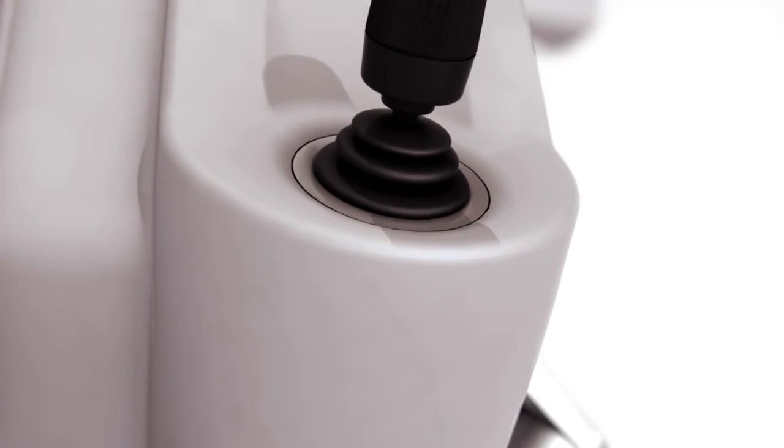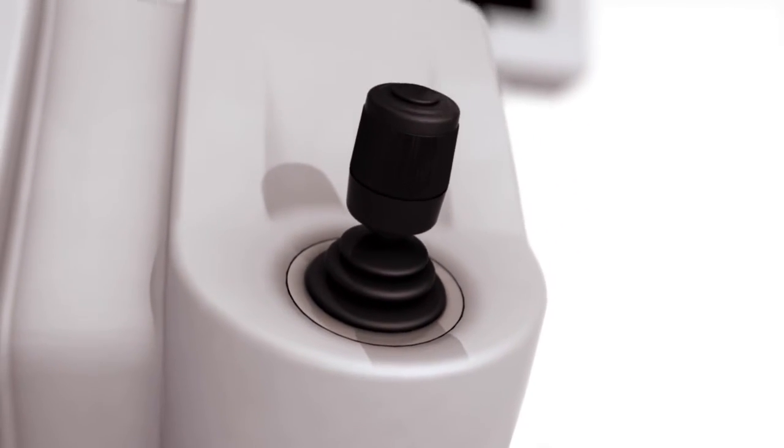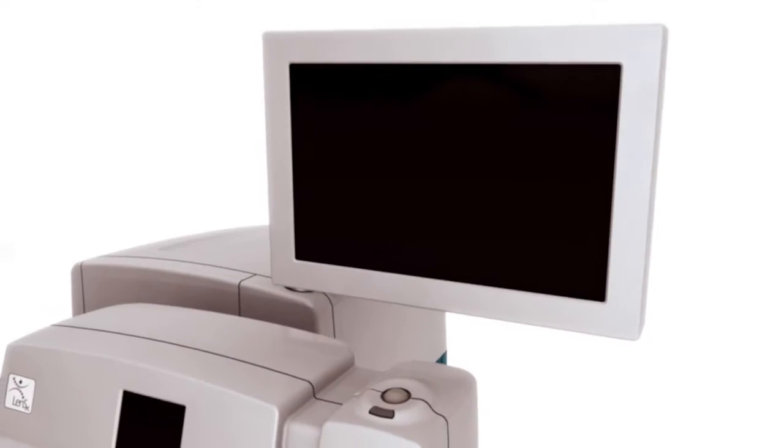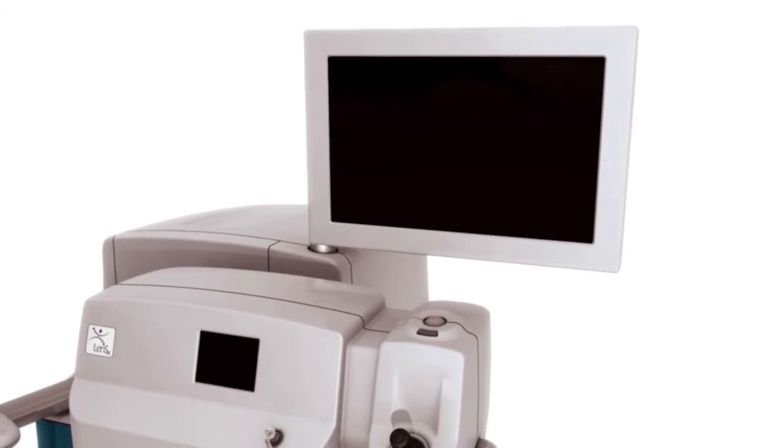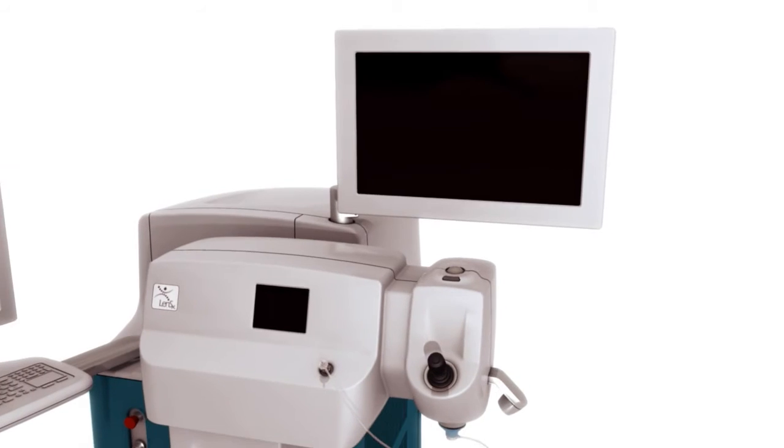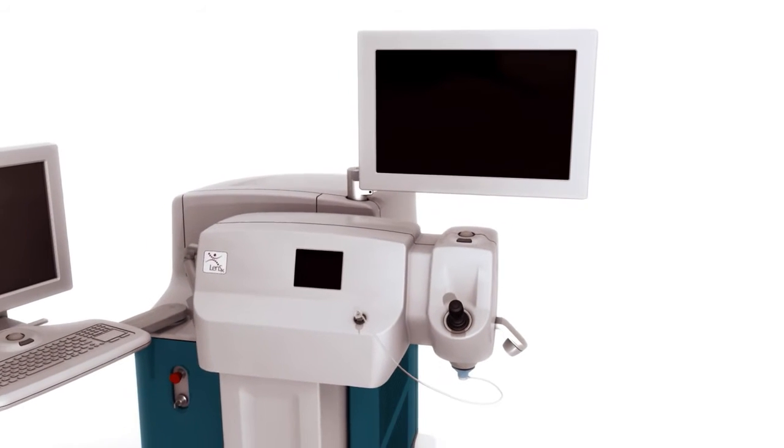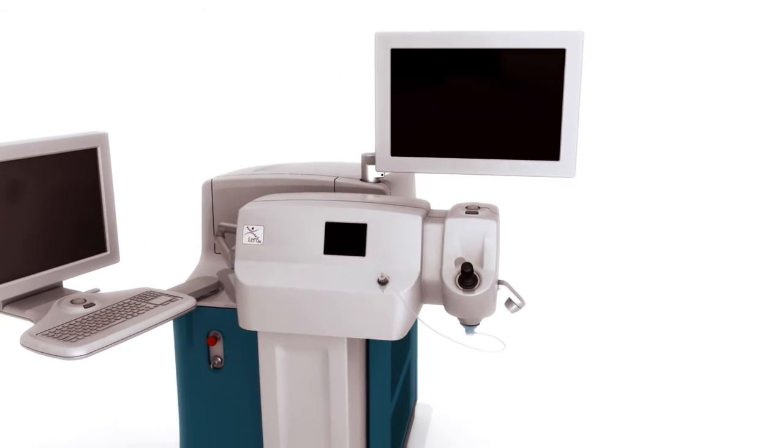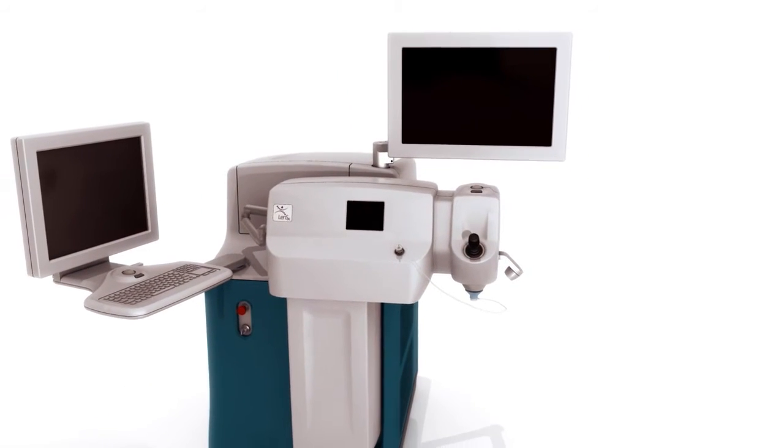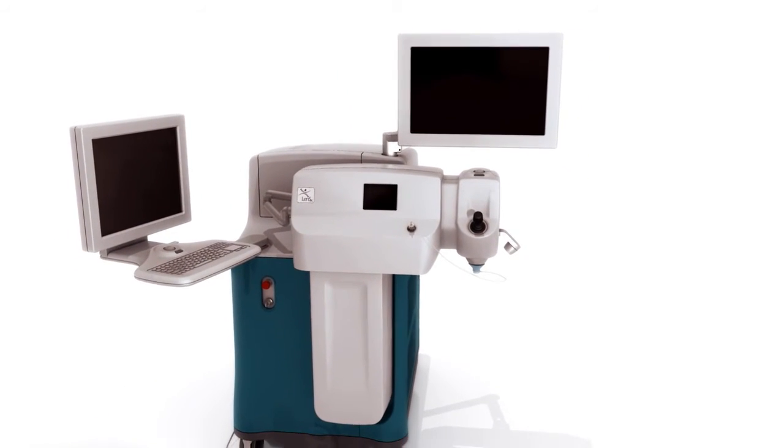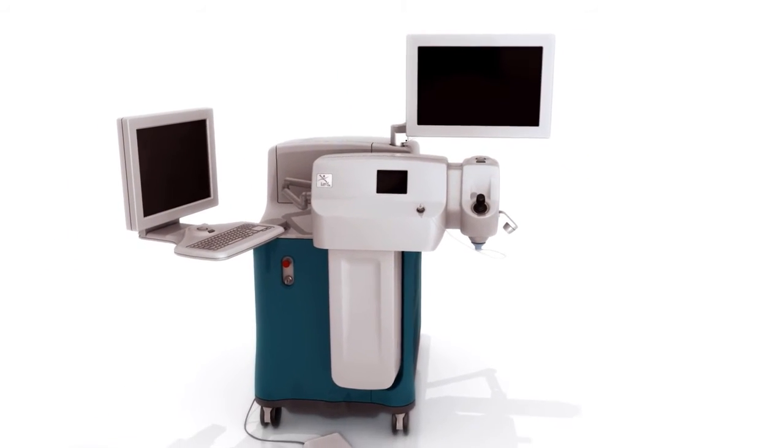Providing cataract patients with a blade-free, technologically advanced alternative, the LensX laser is leading a new era of refractive cataract surgery innovation.